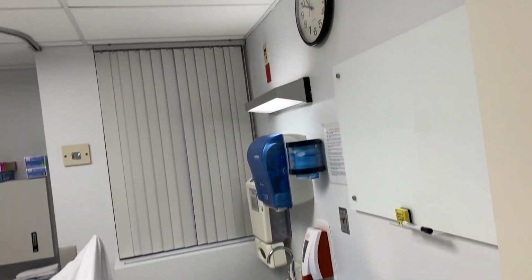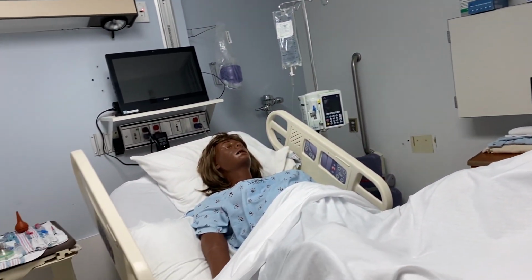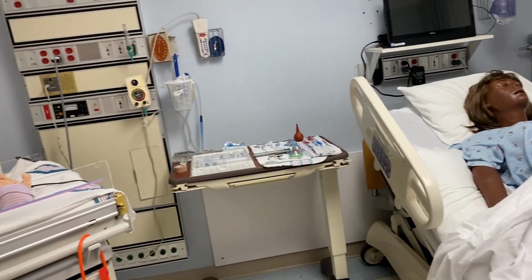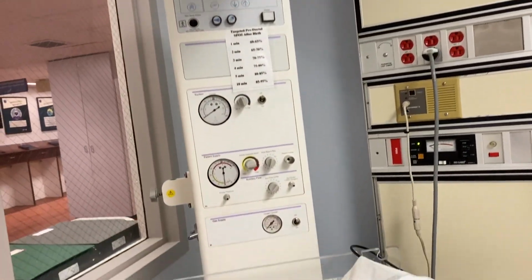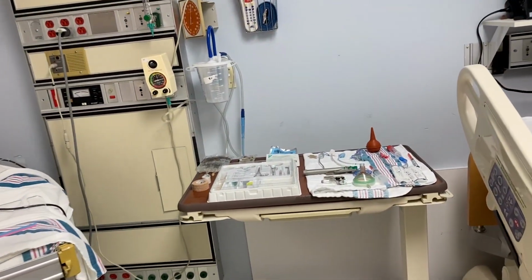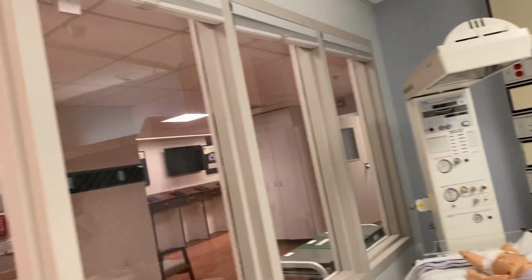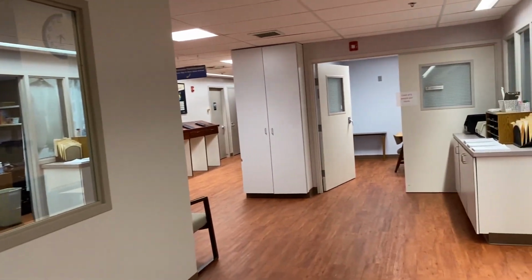This room's set up for some OB simulations with one of our Victoria models and one of our HAL models here. The great thing about being a hospital, of course, is that we get to utilize all of their equipment, and we actually have warmers to mimic what the hospital has. We have this set up for, I think they're doing some umbilical line things, like a neonatal stabilization type of simulation.